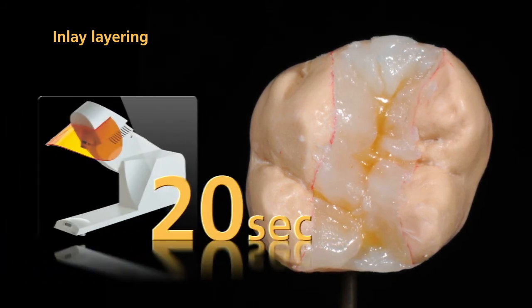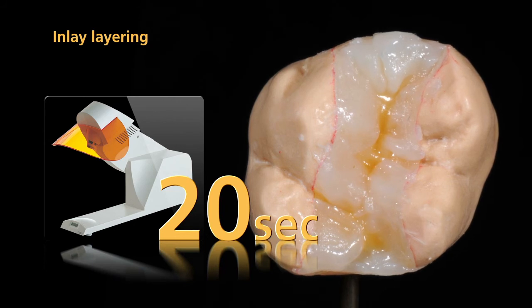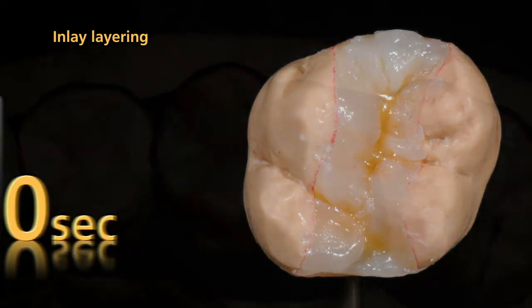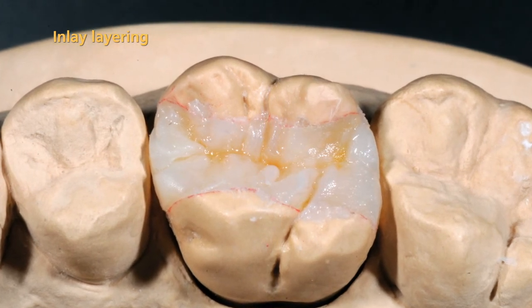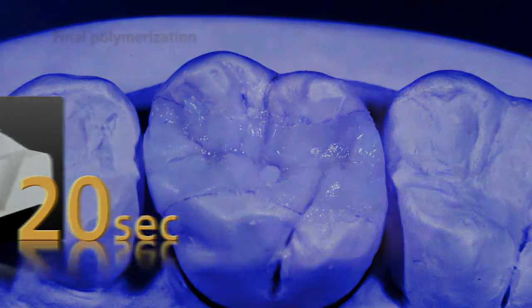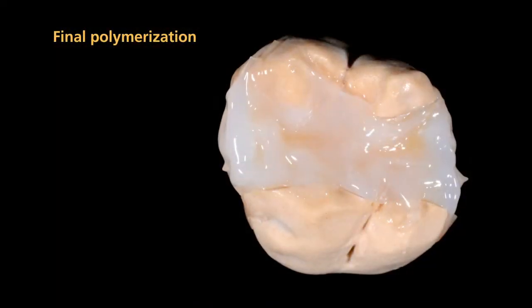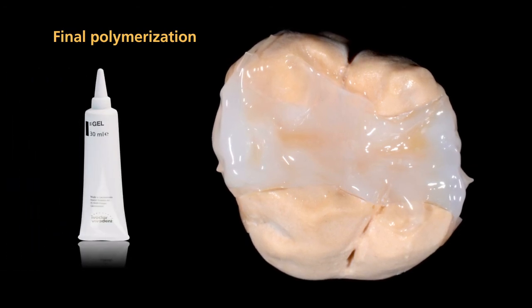Pre-cure the areas that you have built up with Nexco by illuminating each segment again for 20 seconds with the quick. Subsequently, establish a lifelike occlusal morphology and pre-cure all areas for 20 seconds using the quick. For the final polymerization, apply a layer of SR gel onto the entire Nexco surface.